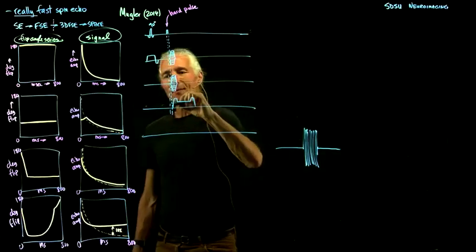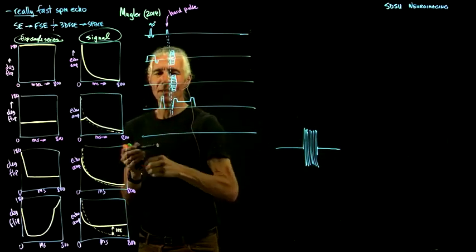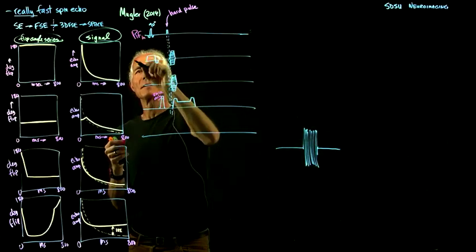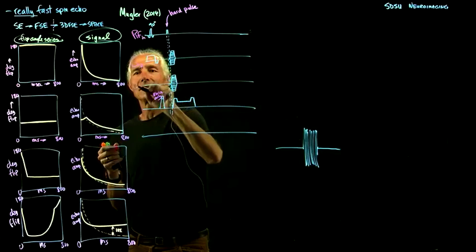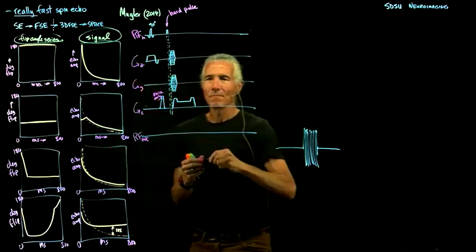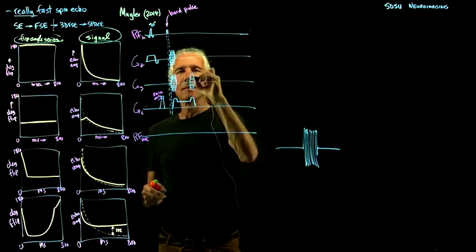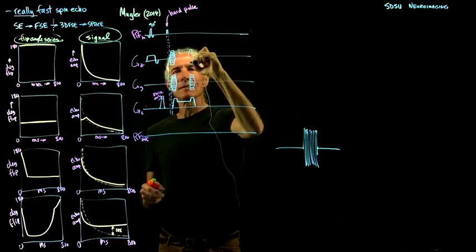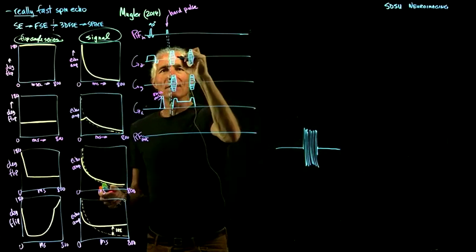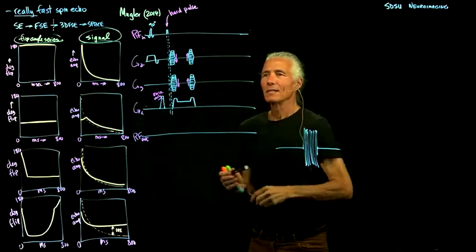And then we've got just a single one that occurs once only with a little bit of extra on it here. So this is once only. So this is RF, the Z, Y, X, RF out. Okay, and then as soon as we finish this, we immediately fix up what we did in the phase encoding, because we have to patch up our echoes because we need to reuse them. And so if we were, say, going in this direction, then on the way back we go in the opposite direction. And so now we're ready to go again.